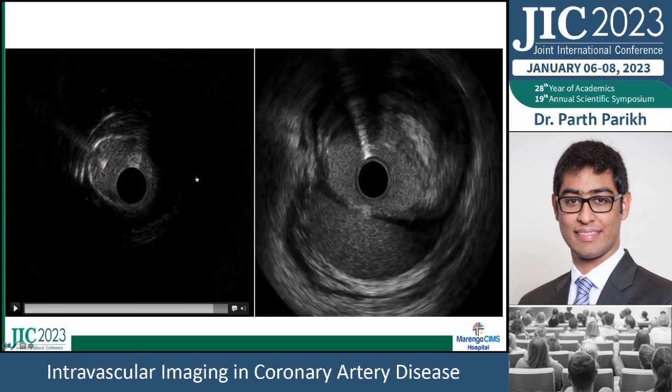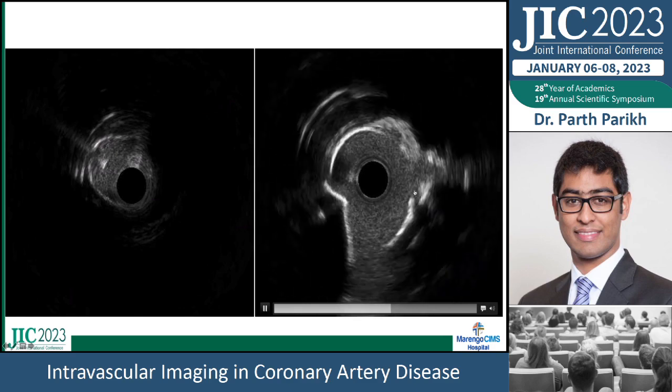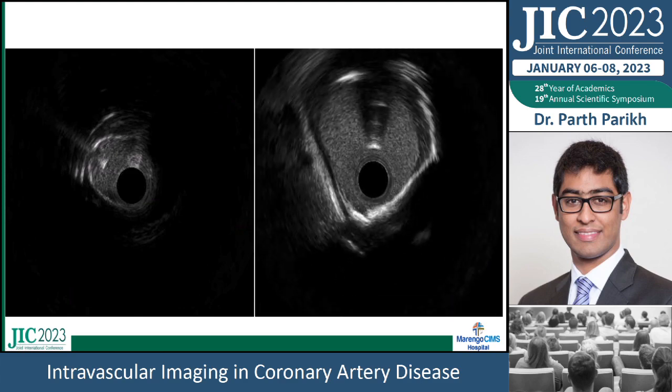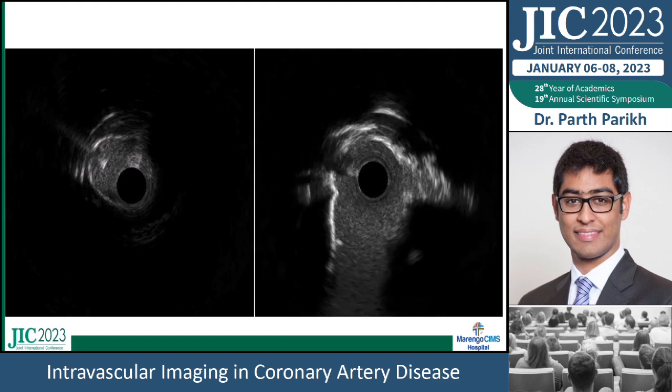So we went ahead based on this imaging finding. We did cutting balloon angioplasty first to prep the lesion to make breaks in the calcification. So we used a non-compliant balloon and then a cutting balloon, and you can see over here that with the cutting balloon, it causes a dissection with a hematoma in the left main going into the LAD, and then you see this calcium chunk which is broken out, which means that we have been successful in making breaks in the calcium, and if we were to deploy the stent now, it would expand properly, which if you think about it, if there's calcium all around, then the stent is not going to really expand well.